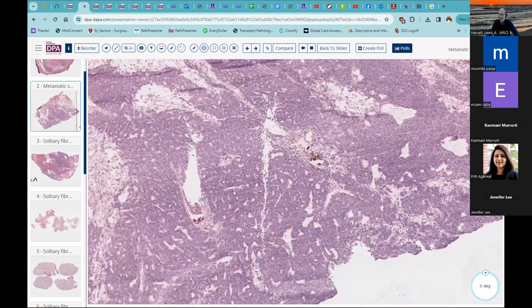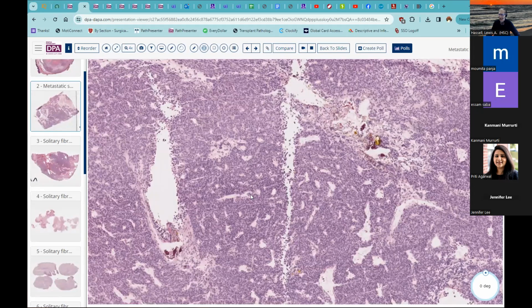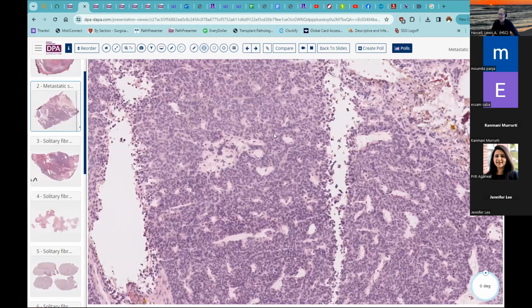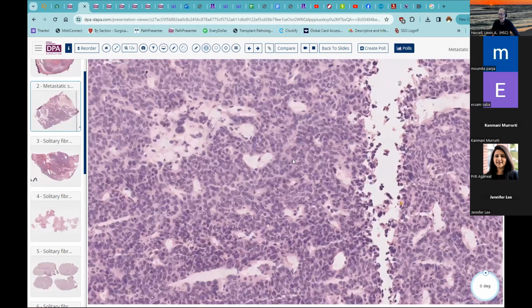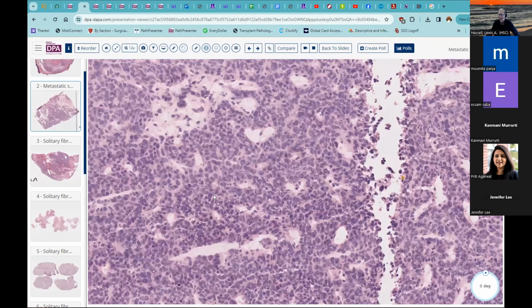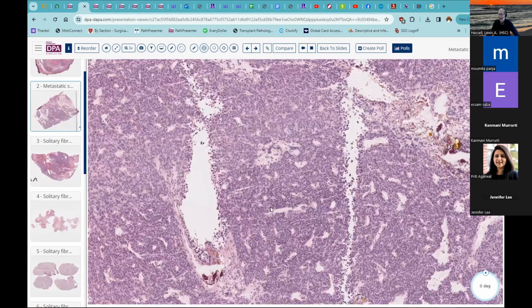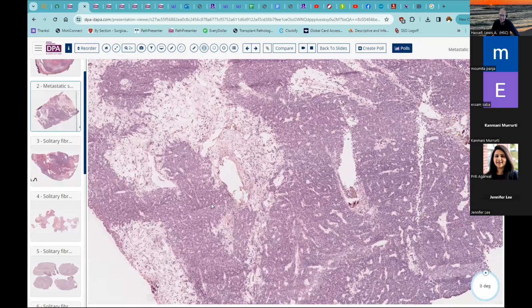And predicting malignancy in this tumor is a challenge. In this case, the cellularity, the degree of atypia that's present might have helped you, but this is obviously the metastasis. So this is the proof that it's a malignant one rather than doing so from the de novo initial presentation. So any questions about these two lesions that we've covered thus far?